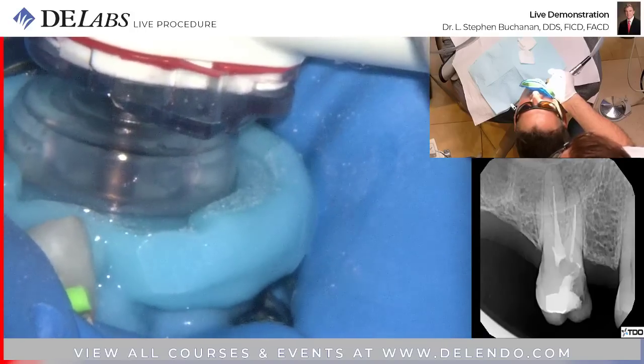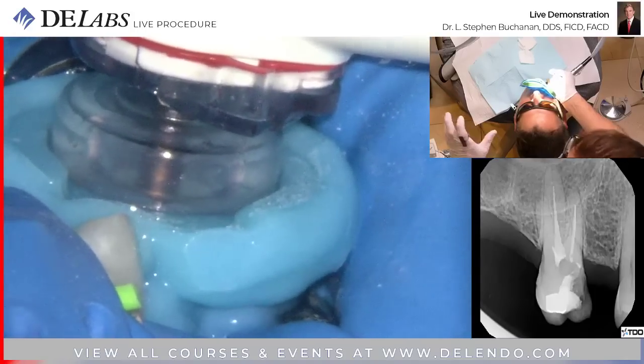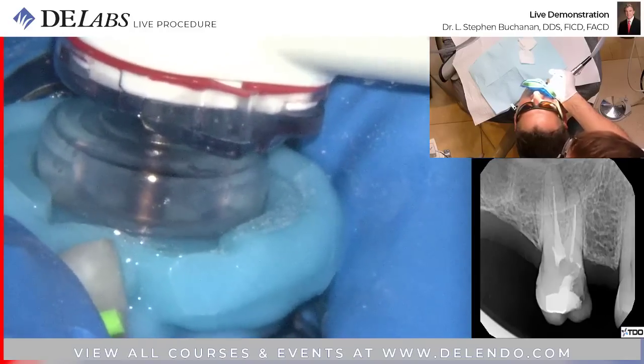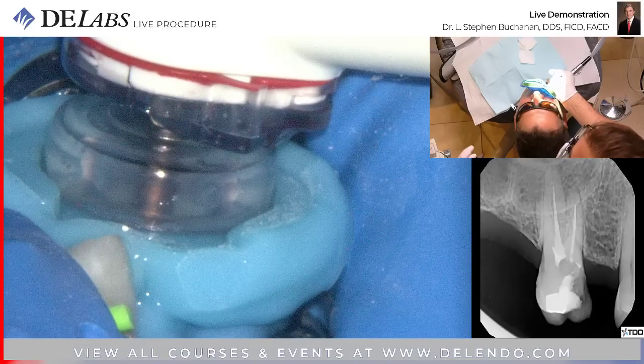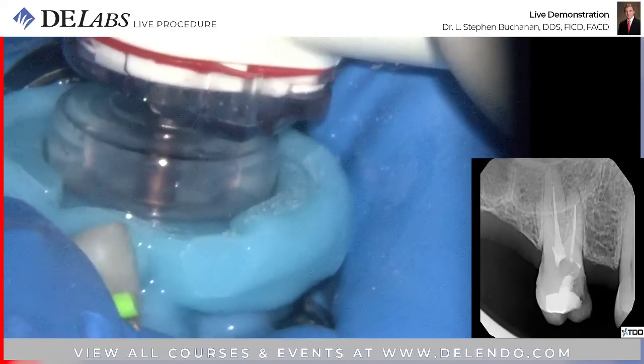You know, when you're trying to find a canal or pick through one, you have an impediment you're having a tough time with, it helps me to get the assistant out of the operatory because the aura of boredom is really, it just kind of puts me off my game. It's like, you're out of here. And then you find it.